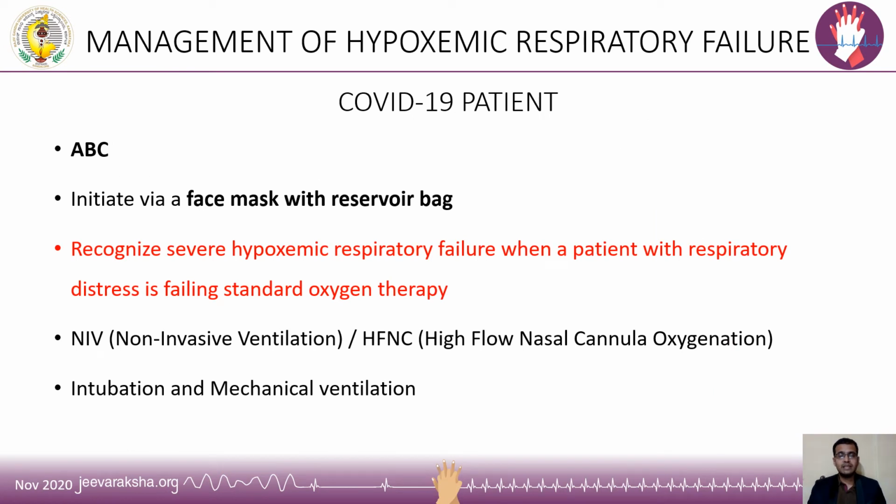So these are the basic airway adjuncts and their techniques with respect to any hypoxemic patients. When it comes to COVID-19 specific patients with type 1 respiratory failure, how are you going to manage it? The dictum remains the same. Airway, breathing, circulation becomes your priority. As we're talking about airway, I'm going to talk a little bit in depth about airway optimization. In patients with type 1 respiratory failure, especially COVID-19 patients, you will have to initiate oxygen delivery devices, preferably a face mask with reservoir.